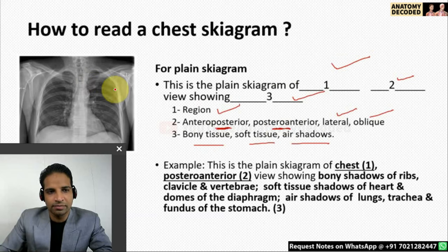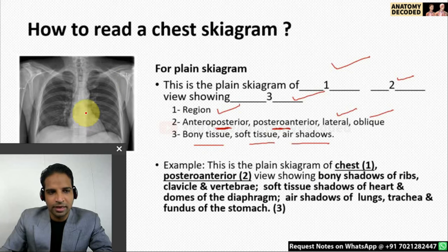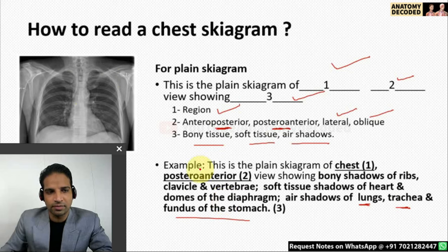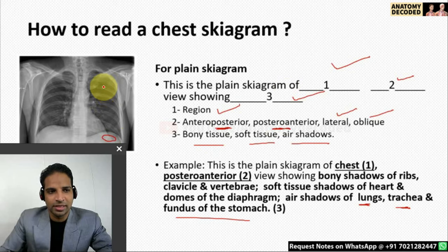This is a plain skygram example. There is a plain skygram of the chest, posterior-anterior view, showing bony shadows of ribs, clavicle, and vertebrae in the midline. Then soft tissue shadows of the heart, lungs, and domes of the diaphragm. Then air shadows of the lungs, trachea, and the fundus of the stomach, which may contain some air in this region.